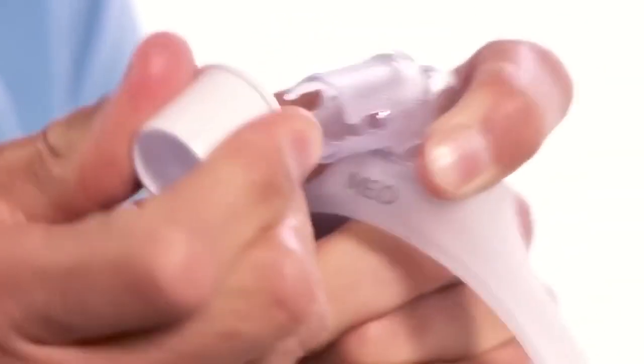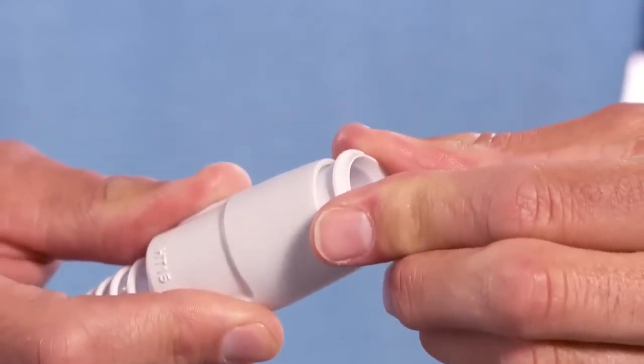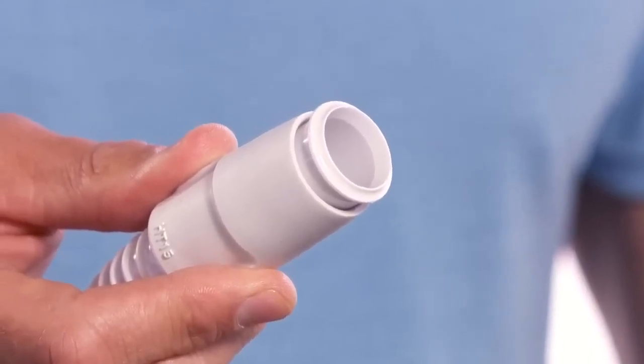Before fitting the mask, insert the tubing quick-release into the tubing that came with the CPAP device. The tubing quick-release lets you easily disengage from the device, which is convenient when you get up to use the bathroom at night.